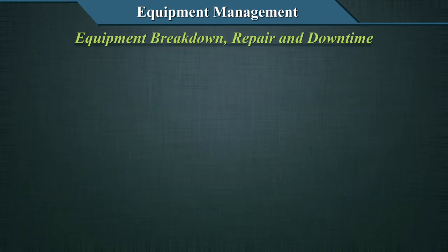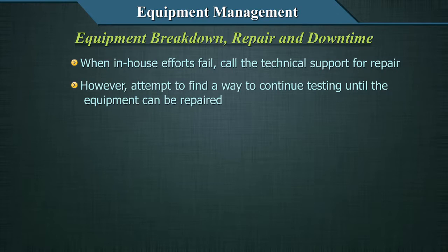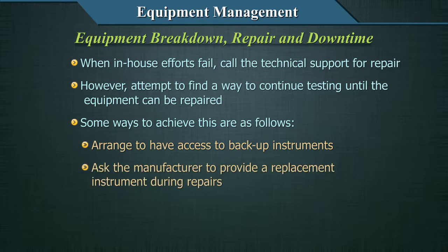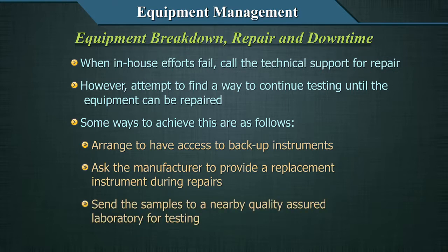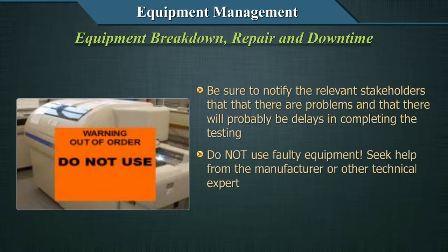Never attempt unauthorized maintenance or troubleshooting steps. Equipment breakdown, repair, and downtime: when in-house efforts fail, call technical support for repair. However, attempt to find a way to continue testing until the equipment can be repaired. Arrange to have access to backup instruments, ask the manufacturer to provide a replacement instrument during repairs, or send samples to a nearby quality-assured laboratory for testing. Be sure to notify relevant stakeholders that there are problems and that there will probably be delays in completing the testing. Do not use faulty equipment.